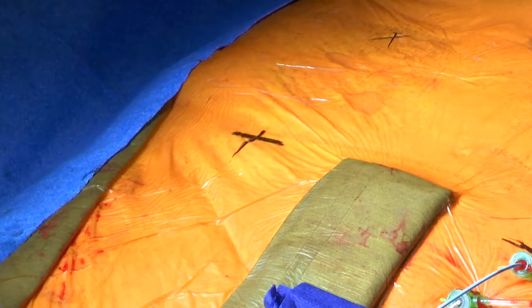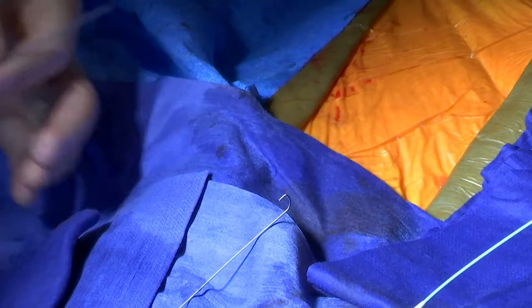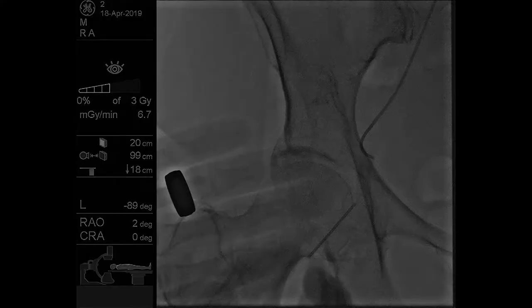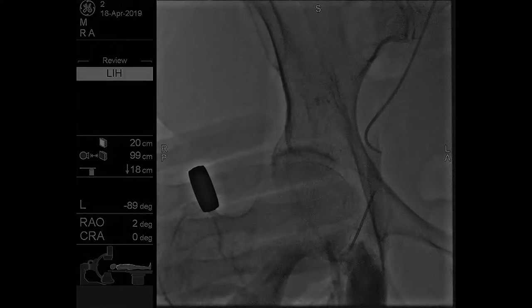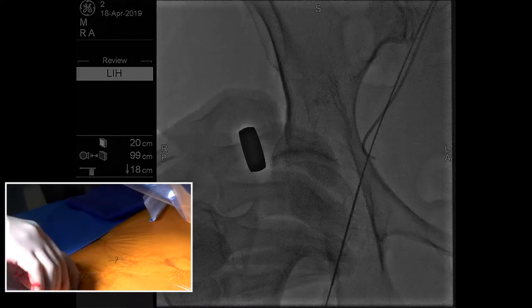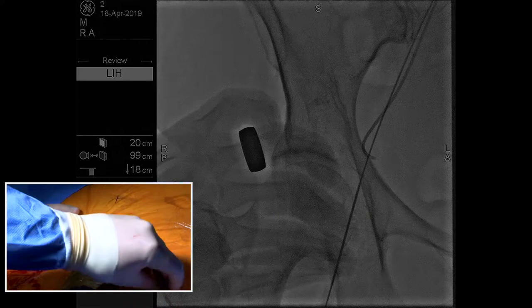Perfect. All right. So we're just going to take a simple 18-gauge needle, put our table underneath the x-ray camera. I'm going to go into the tissue tract, and then Ray's going to give me a tiny puff right there. So see, I want to make sure I'm right on top of that artery. Yeah. Right there, okay? And I'm in, and I got good flow, and I'm going to pass my wire. Okay, so now we're in, and now you can take that rim catheter out. Yeah. Let's go ahead and give 5,000 of heparin, please.